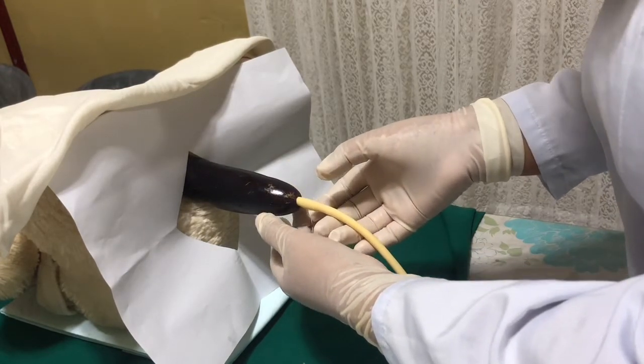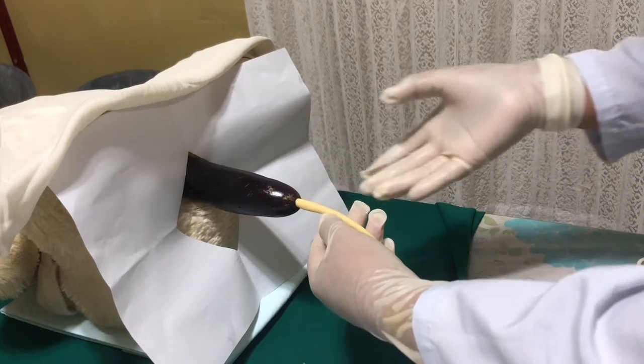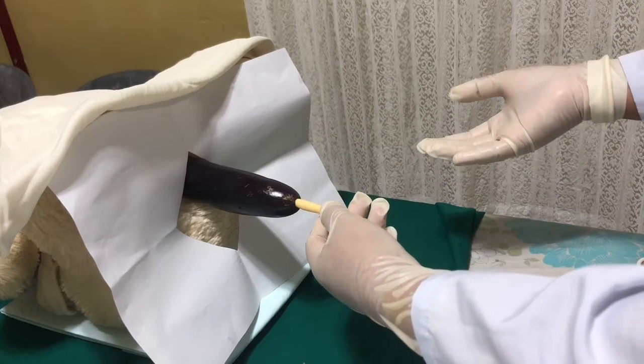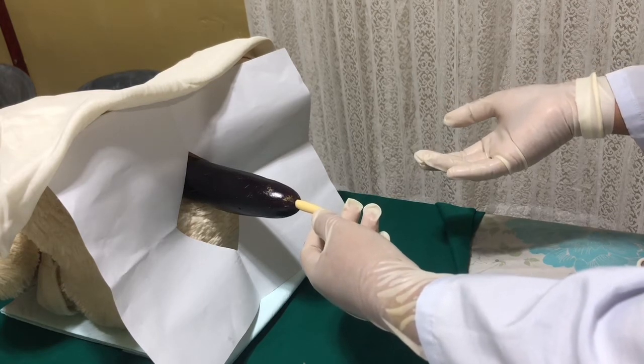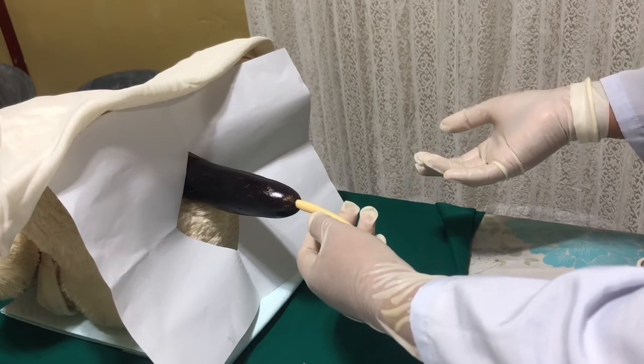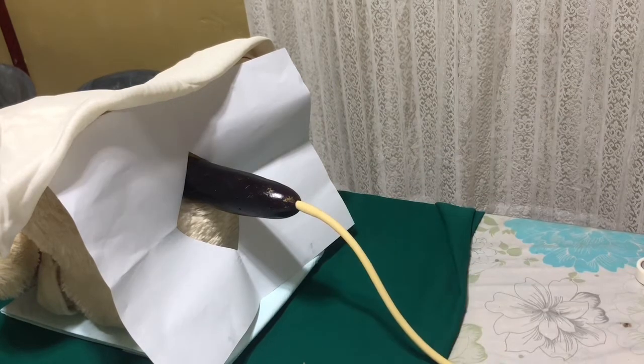So, hold the catheter securely with your non-dominant hand while the bladder empties. Collect a specimen of about 20 to 30 ml if required. Continue drainage according to the hospital's policy. Remove the catheter smoothly and slowly.